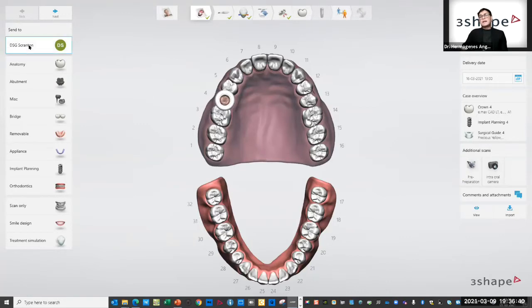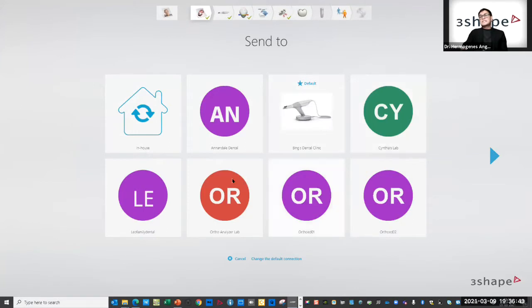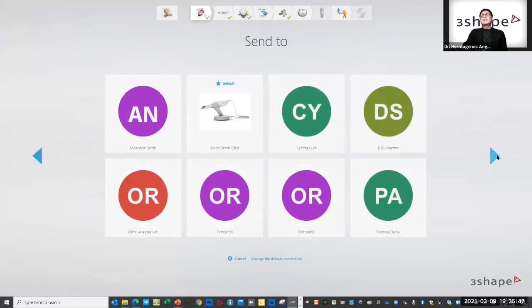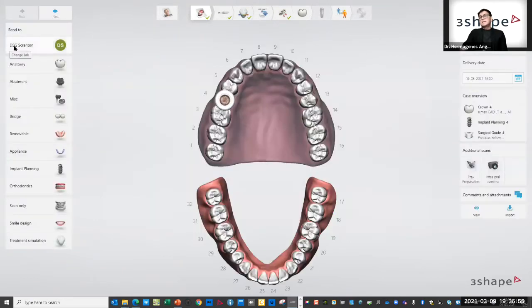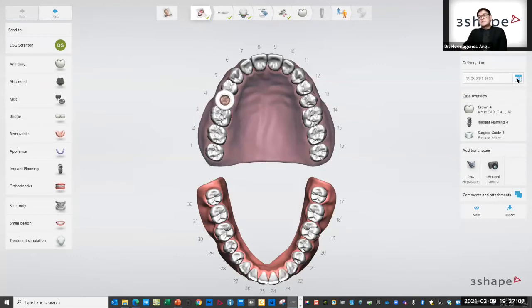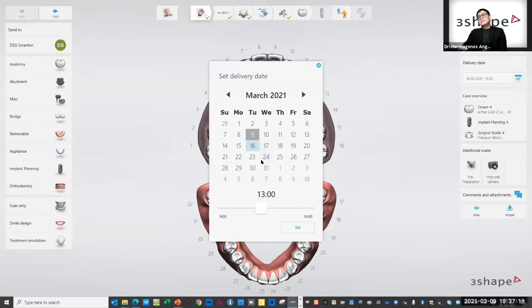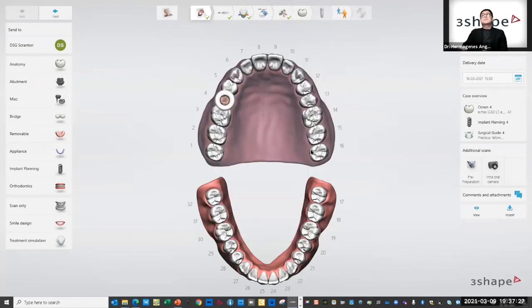After choosing the lab under 'Send To,' I'll show you the sample labs I'm connected with — if I scroll to the right there's my DSG sample laboratory. Once I chose that, DSG appears under the 'Send To' box. On the right side of the screen we have a calendar. You click it and set a date — this is the delivery date of your surgical guide, meaning when you want your surgical guide back from the laboratory. After choosing the lab and the date, you click 'Set.'